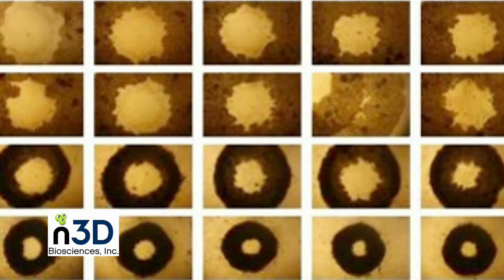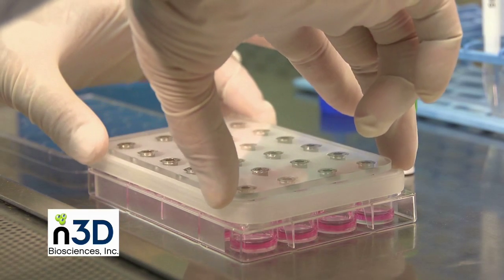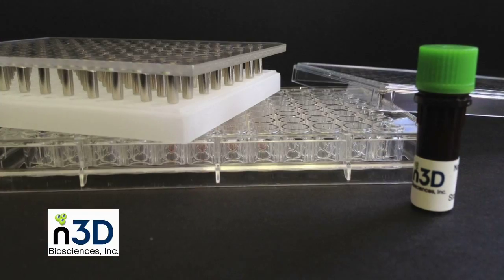No artificial gels or scaffolds are used and no expensive equipment is required. Versions of the BioAssembler are available in single-well, 6-well, 24-well, and 96-well formats.